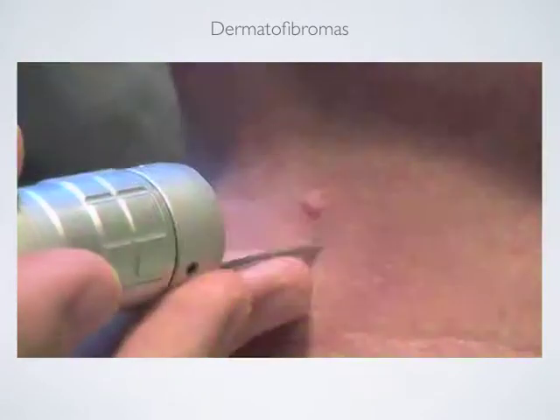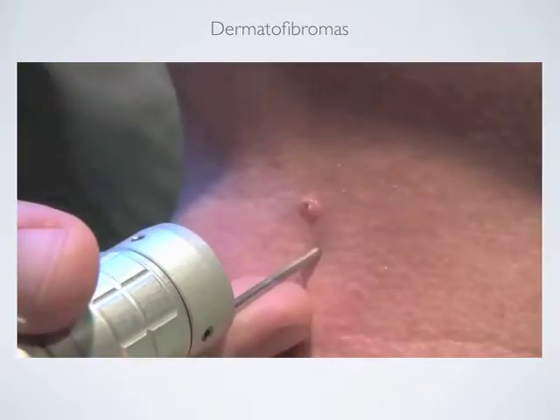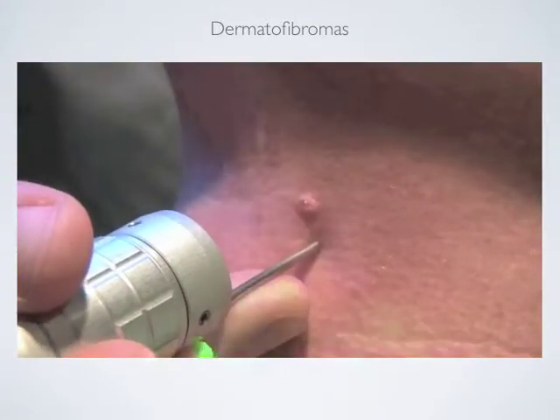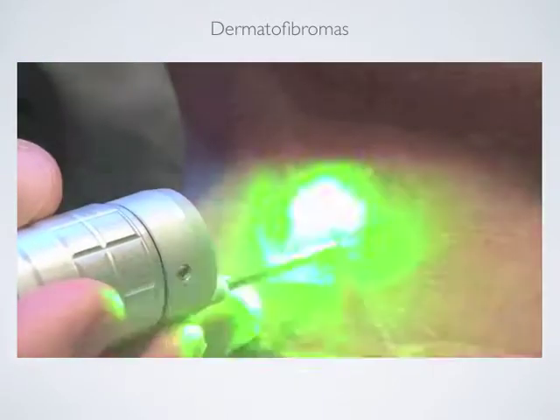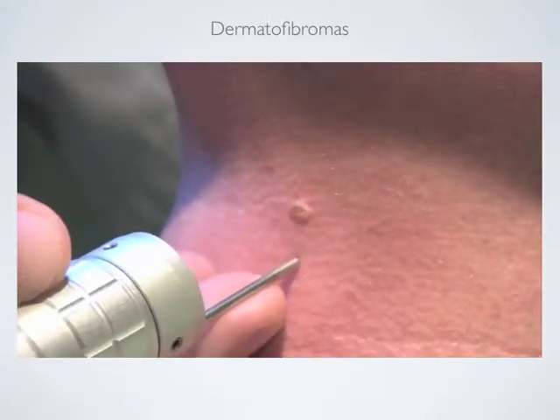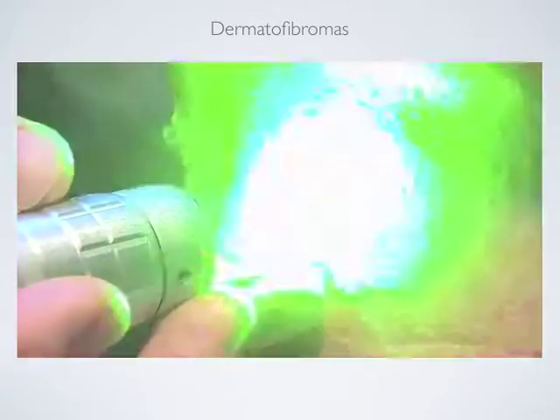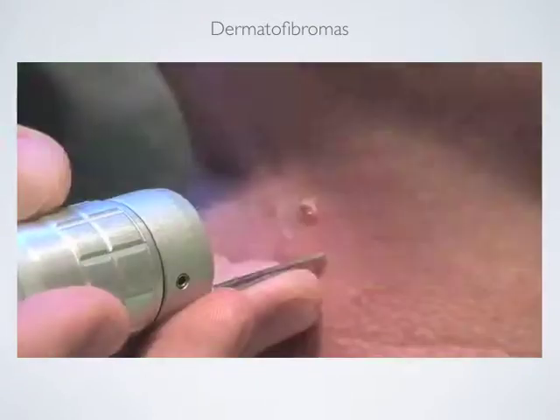Treating dermatofibromas is quite easy. The first stage is to make them turn darker and grey. The next stage is the ablative phase. You can speed up the treatment without any kind of anesthesia because the first stage, when the lesion turns grey, is perfectly tolerable, and you start ablation only after the necrosis, when the feeling is not there anymore. The slow ablation goes on and it is obviously more aggressive than in other cases. However, as you will see, without changing a lot, you can go on into continuous wave mode.